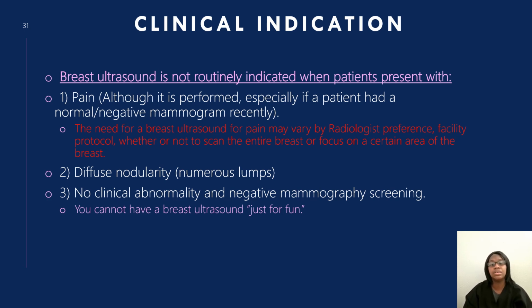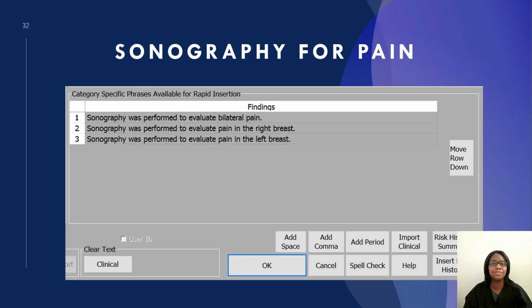So then you also have, if a patient comes in with several lumps, then it's normally not routinely performed if a patient has several lumps all over their breast. And then you can't just perform it for fun. So just make sure that you're not in there just scanning the breast because you want to do it. And then if a patient comes in for pain, this is just how I would annotate.